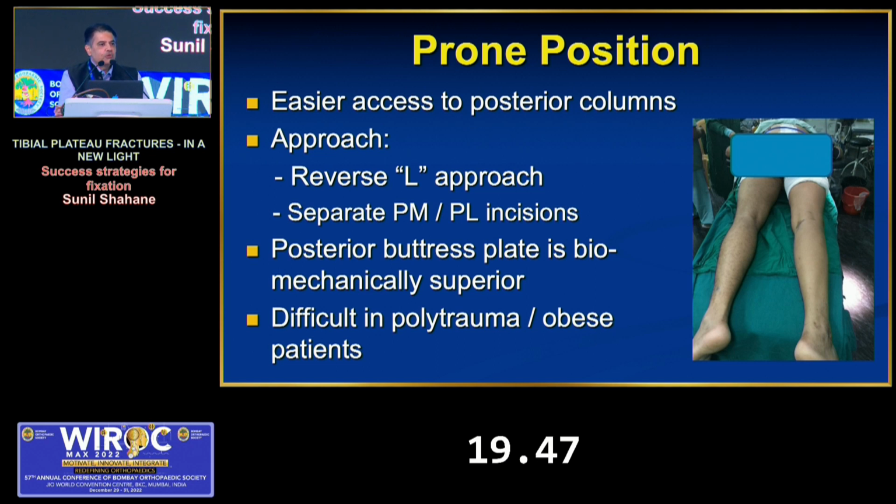You can fix your posteromedial and posterolateral fractures. Another advantage is because your knee remains in extension, these fractures are easier to reduce, and a posterior plate with posterior to anterior screws is biomechanically stronger than trying to fix these posterior fractures from the front.